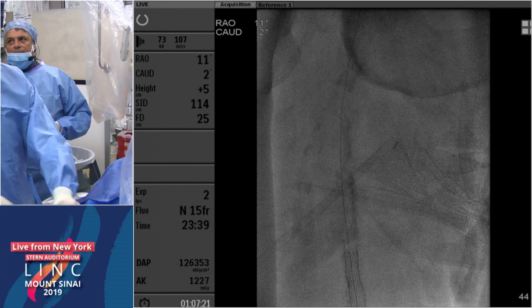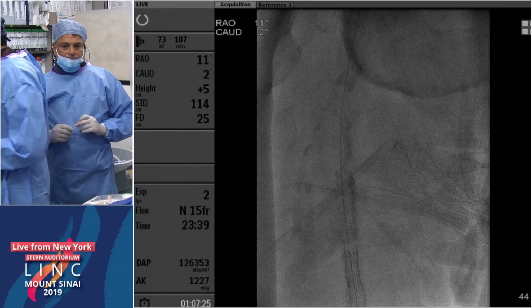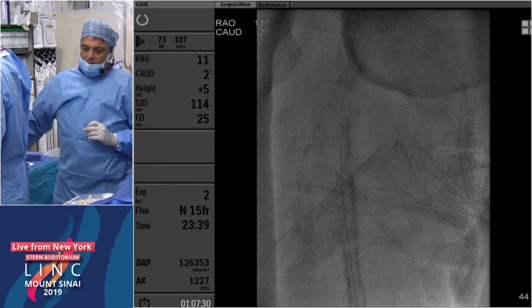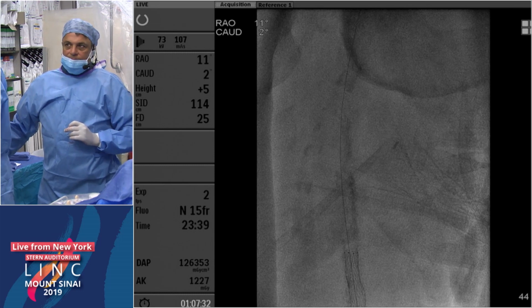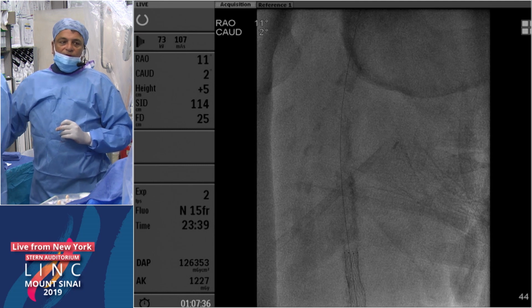How will you manage him, the patient, post-procedure now? It's a little more complex. You have a covered stent in place. Will it change your post-procedural antiplatelet therapy, either for type or duration? Well, there's no question, Mike.